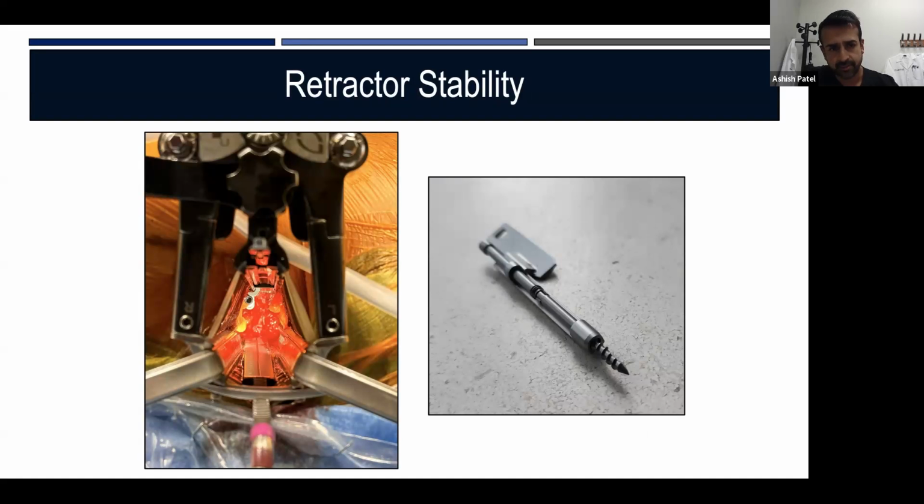We've developed a screw shim that goes down the posterior blade, and the posterior blade is preferred over the craniocaudal blades. It just depends where your craniocaudal blades are. Here you can see that they're pretty anterior, and so placing a screw shim down there may not be ideal. But the other thing is that it also prevents the posterior blade from deflecting ventrally.